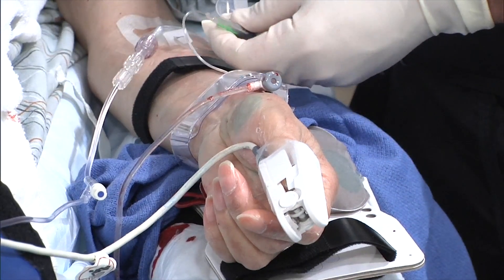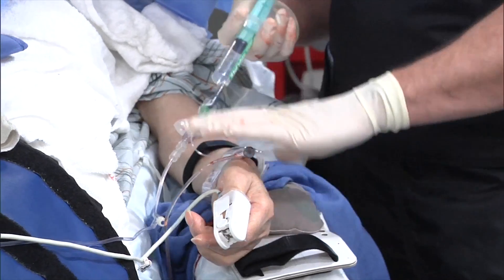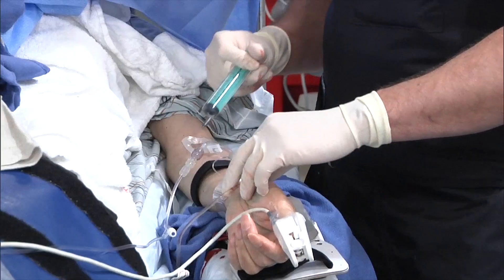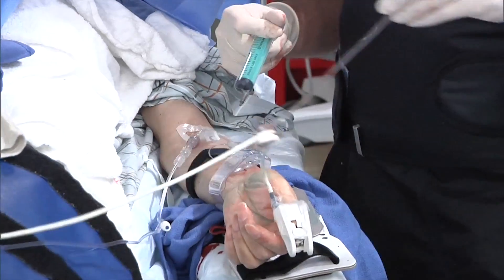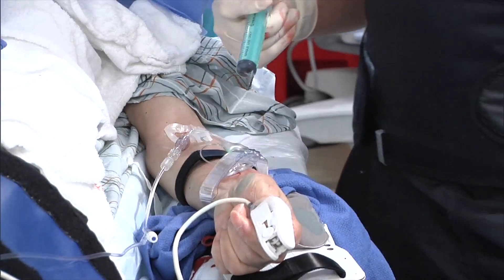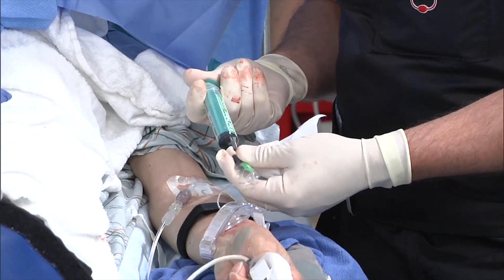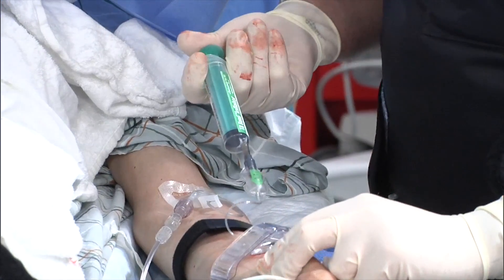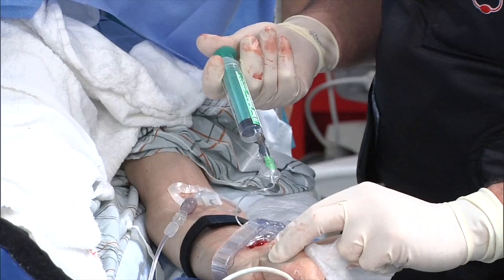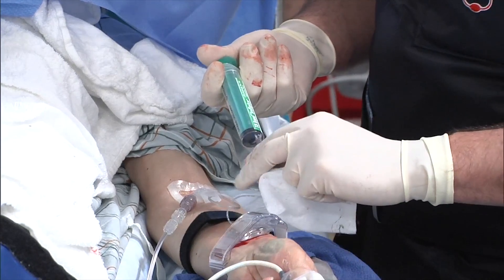I'm going to get 15 cc's of air — and this is a syringe that's proprietary, so you won't accidentally inject the sheath with air. That's why it was made that way. I'm going to inflate this with 15 cc's of air. Gets pretty tight. Now I take the sheath out completely and put that to the side. So now I have complete hemostasis. With my finger over the back of the plunger, I release a little bit of air until I see bleeding — that's one way to indicate that the artery is open, which I see there. And I put another cc back in until I get hemostasis, which is right about there.